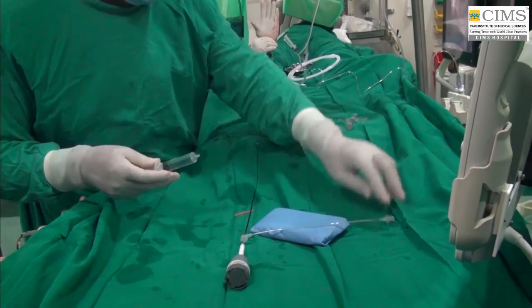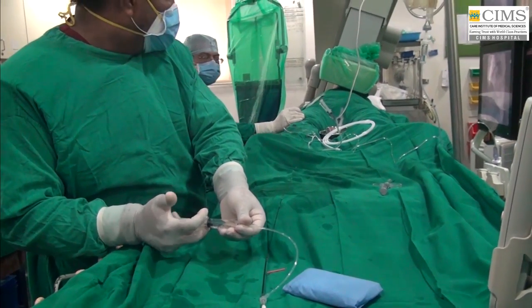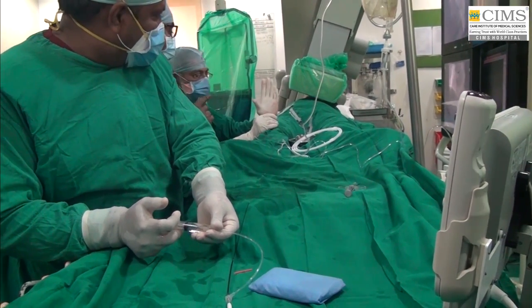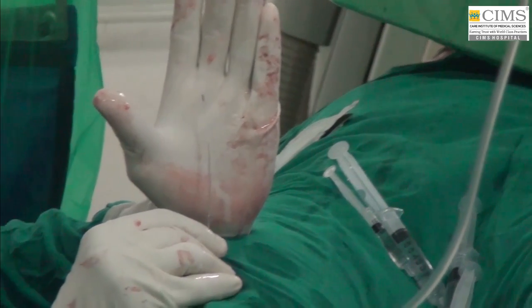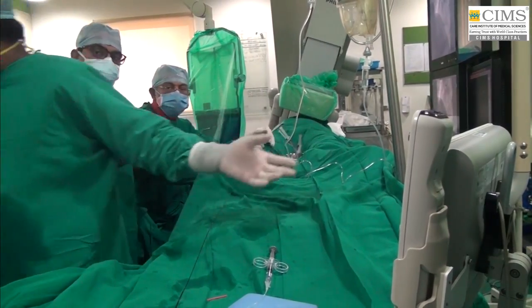Okay, so here you are actually going with the OCT catheter. What are the precautions you take while going with the OCT catheters? Any specific precautions, Dr. Keyur? Yes, very minimal, but a couple of them. One is we have to purge the catheter, as the nurse with me, Joel, is purging.